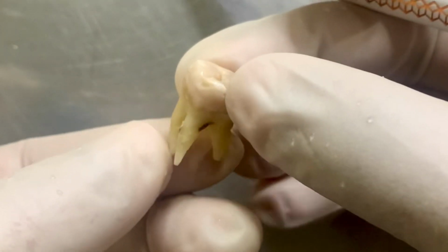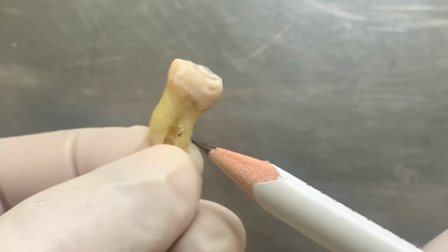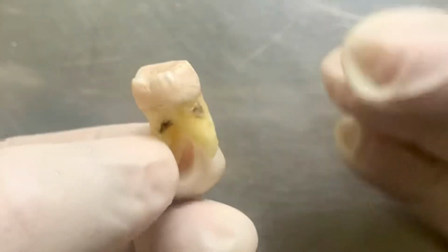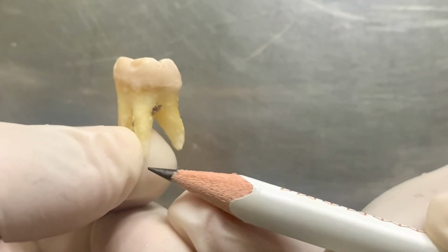This is a maxillary molar having 3 roots. This is the mesiobuccal root, distobuccal root, and the palatal root. It has a rough length of 21 mm.